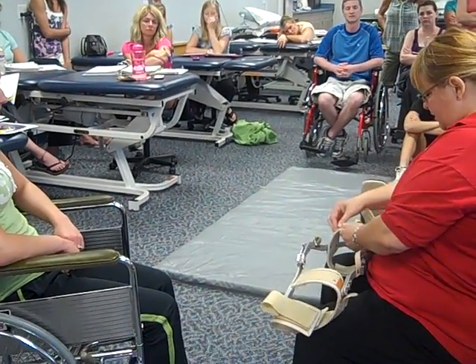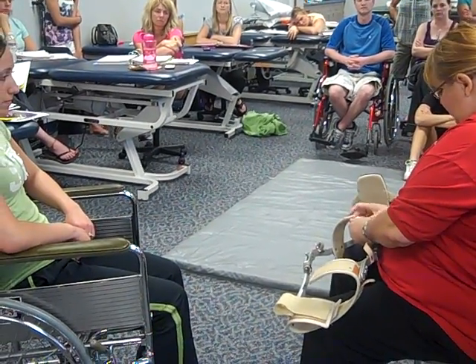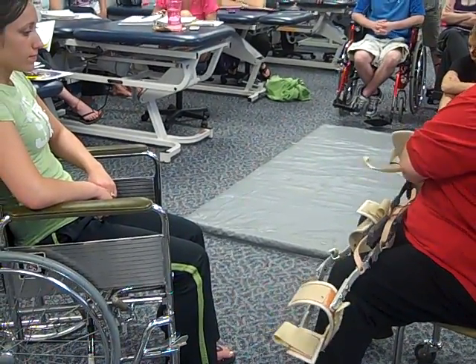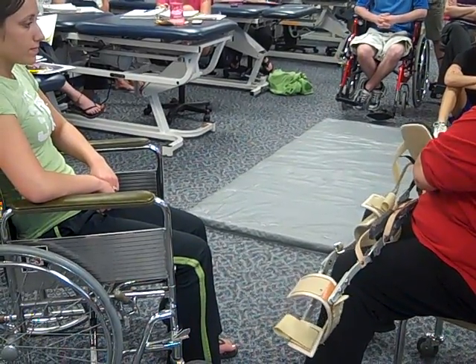Open up all the straps. And then there are some straps down here on the foot part. We'll adjust those on the way too.